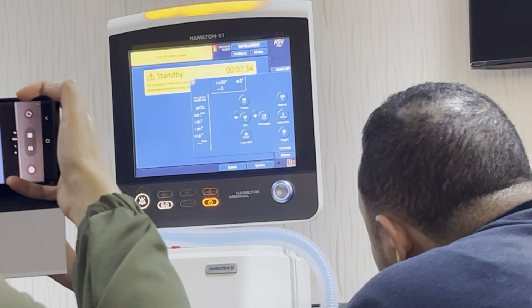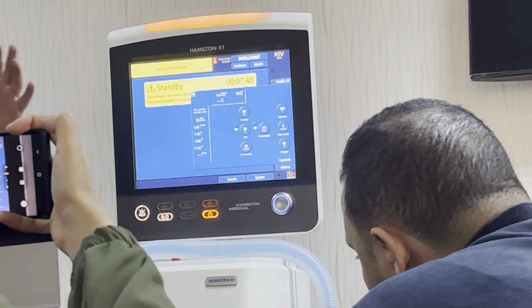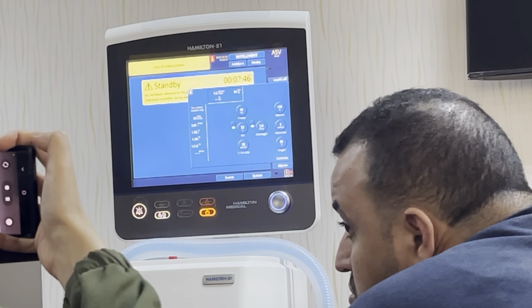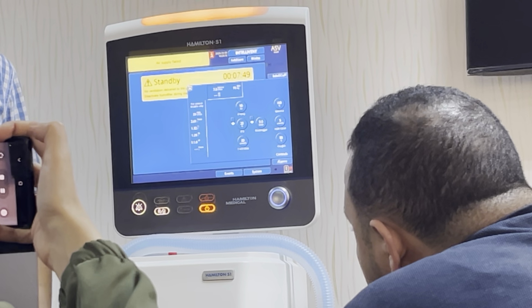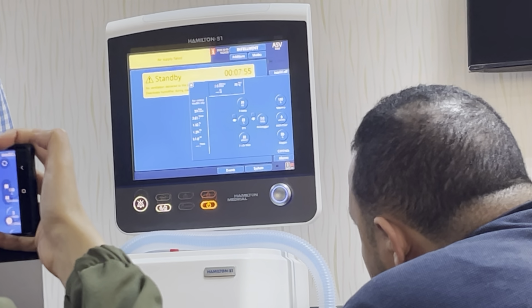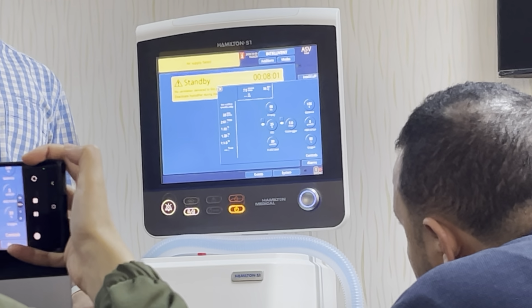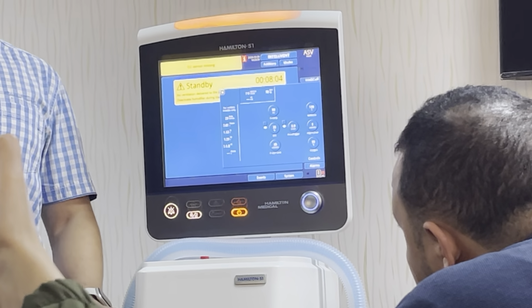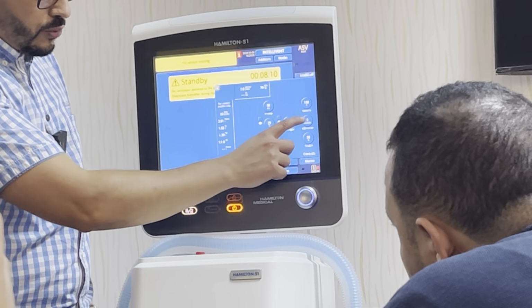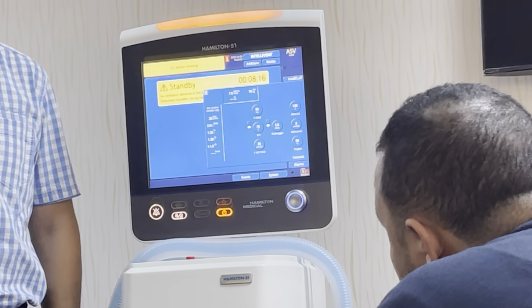The machine will deliver the 7 liter in a combination of tidal volume plus rate plus pressure plus volume according to the patient requirement and compliance and resistance. But the machine will guarantee at the end that the patient will get his 7 liter, the full requirement. Okay? So يعني تو هما الفنتيليتر فيه خلينا نقولوا mainly two direction, to oxygenate the lung and to ventilate the lung. البارامتر نتاع الاكسجينيشن اللي هما الاف اي او 2 والبيب، two parameter to oxygenate and one parameter to ventilate اللي هو minute volume.